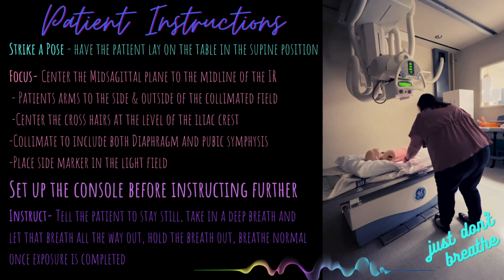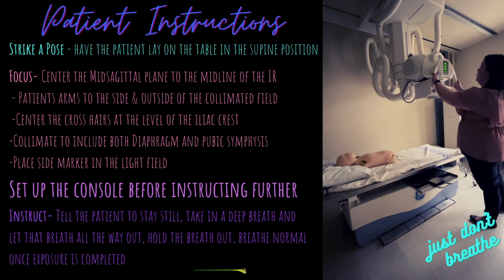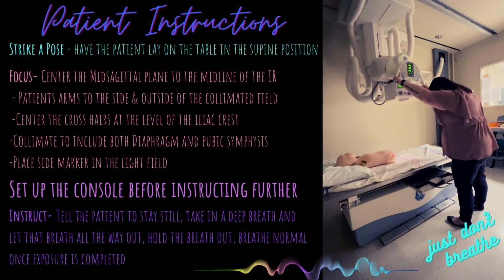Make sure the light field has anatomy included from the diaphragm all the way down to the pubic symphysis. Due to the anatomy of interest, we will not be shielding for this exam.